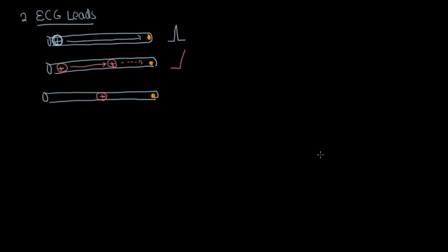another charge pops up and also starts moving this way at the same time that this is continuing to move and at its destination right over here.